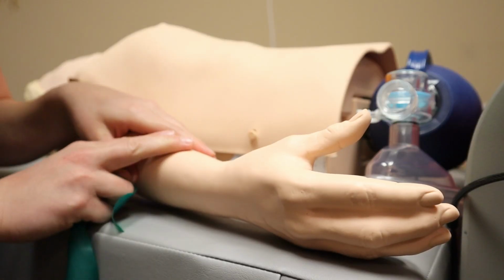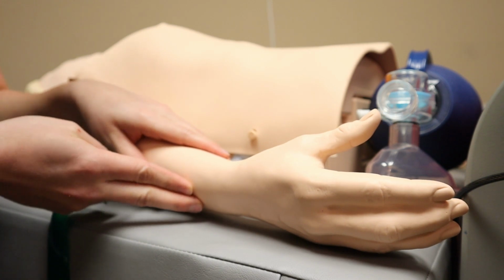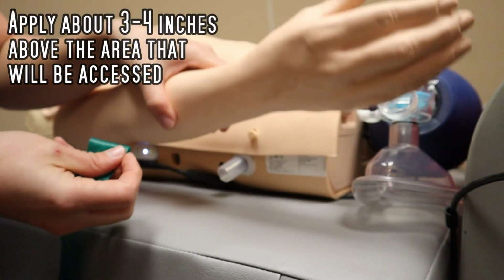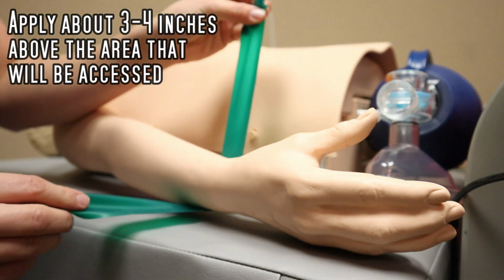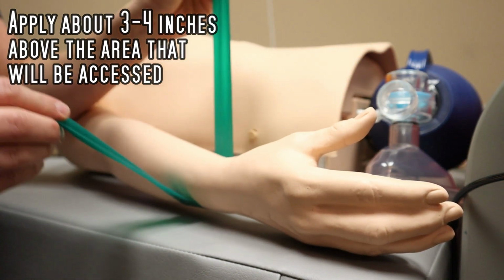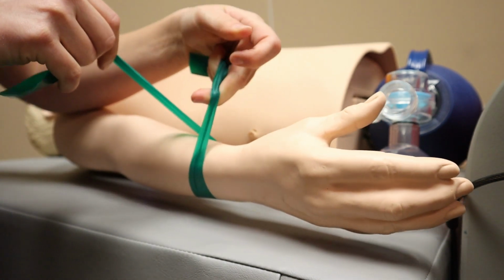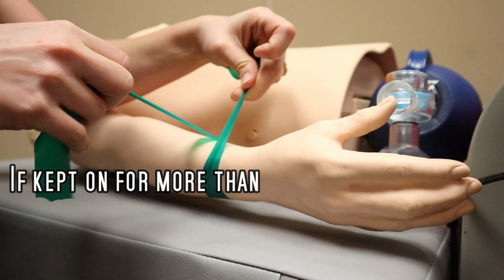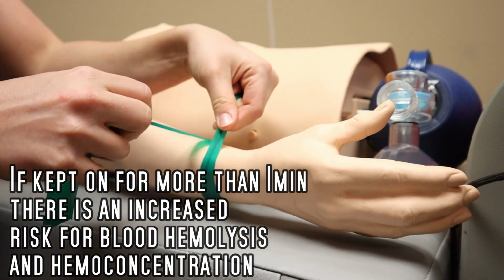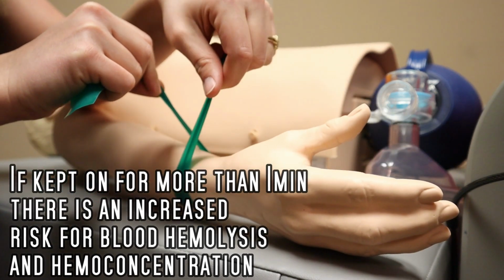Okay, so here you have your patient's arm, and I'm going to place this tourniquet as if we would be placing an IV hand site. So I'm going to put my tourniquet up here. First, you simply just wrap the elastic around the arm. Then you cross them just like you would be tying your shoes. So you see how tight I get that? That's exactly what you want to do, because you want to allow those veins to pump up with some blood. So you see how it is crossed.